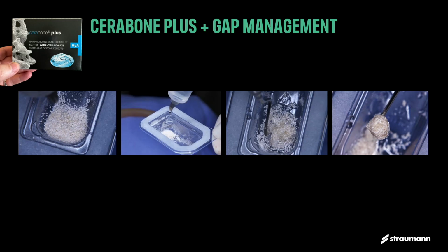We proceed to the gap management. Remember, those are extracted sites. There will be a gap between the implant and the buccal wall. So we want to graft that site as much as possible around to maintain volume as much as possible.